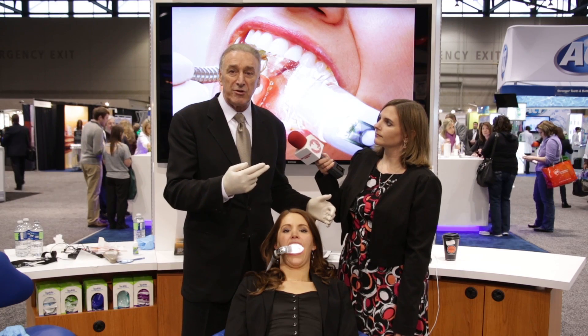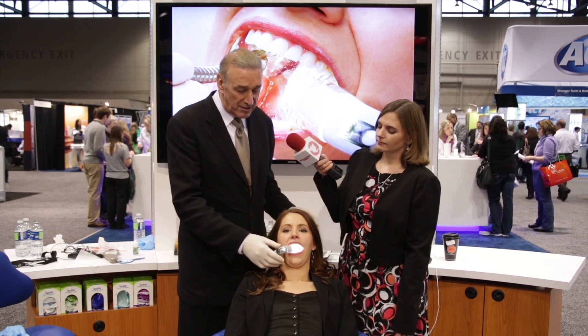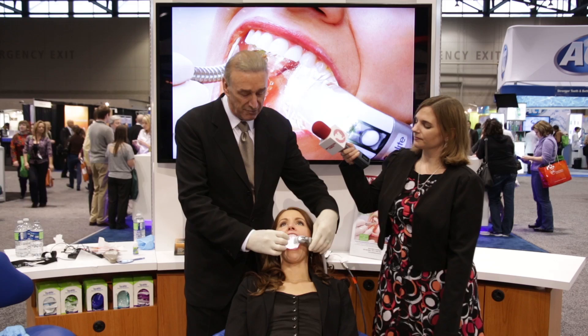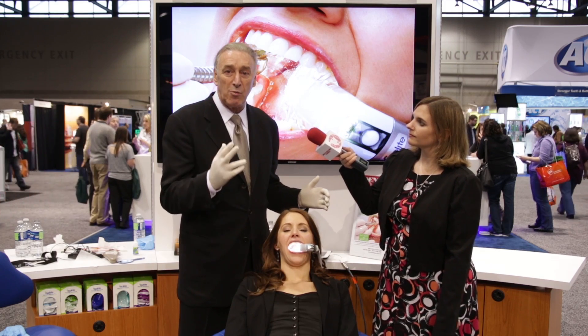Whether I'm working on the upper arch or the lower arch, it works out fabulously. Whether I'm doing the right-hand side or I turn it around to the left-hand side, I'm in control.